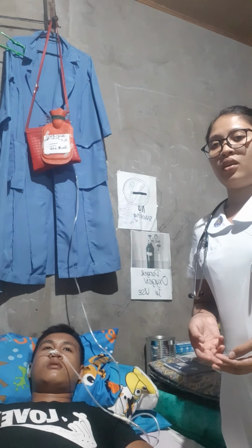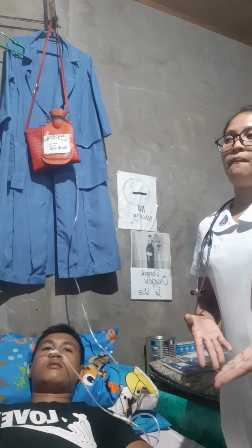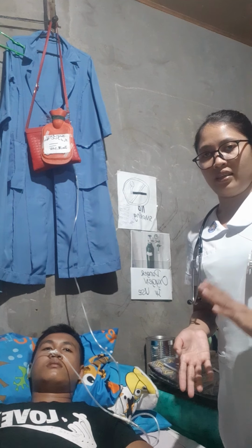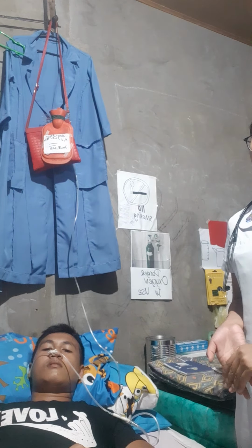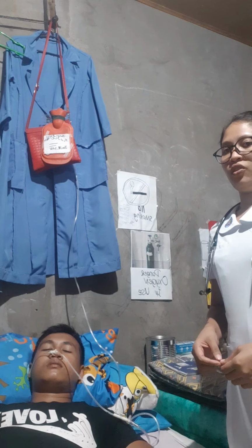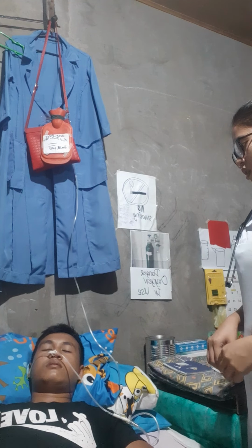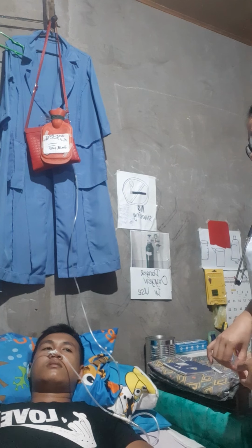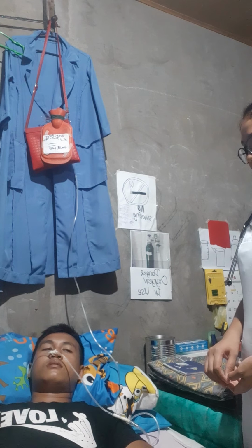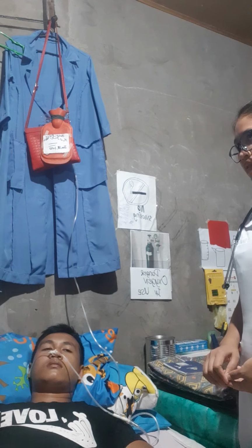But if the client is unconscious, we can check the hospital bracelet, or ask the significant others or family if they are present. Then, we are going to check the chart of the client to verify his identity. Then, next, explain to the client what we are going to do, why it is necessary, and how he can cooperate. So, sir, today we're going to remove that tube attached to you because you are fine now and you can eat something good.